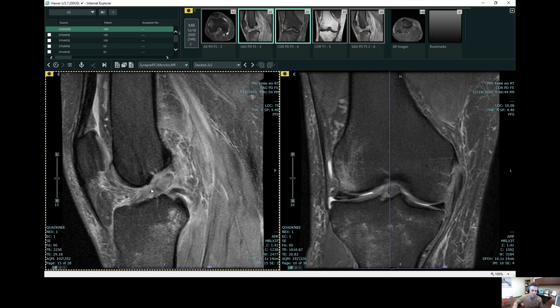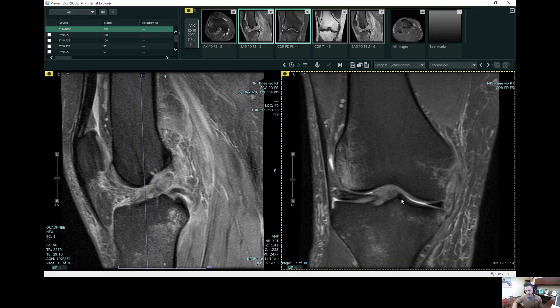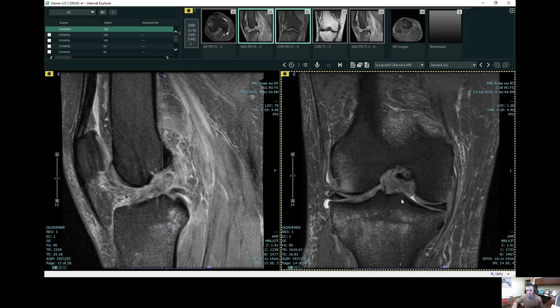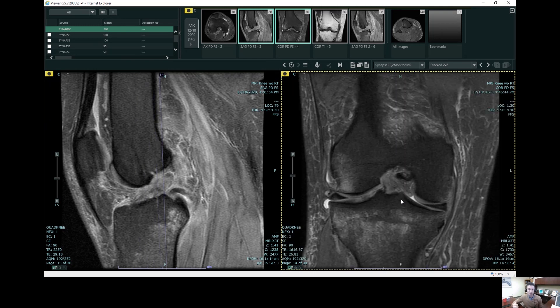So here's the torn and retracted ACL. We can see the same finding here when we look on the coronal image. This is a different view that we're getting.